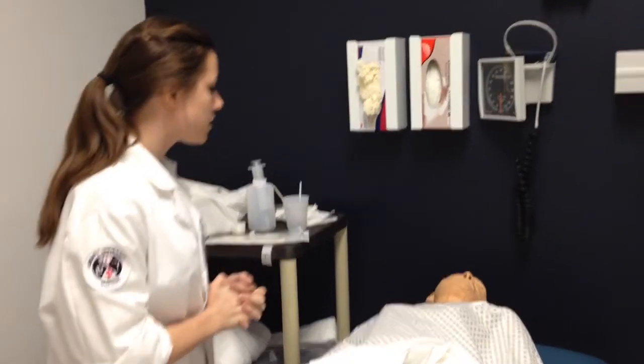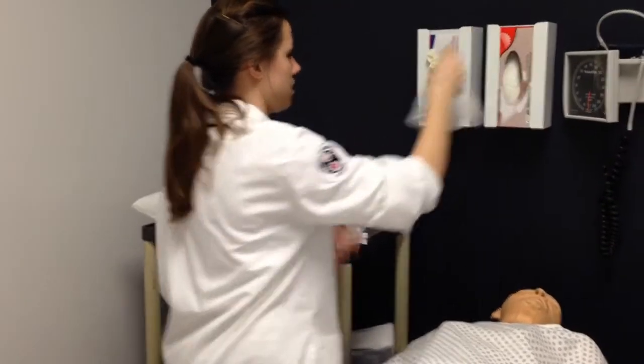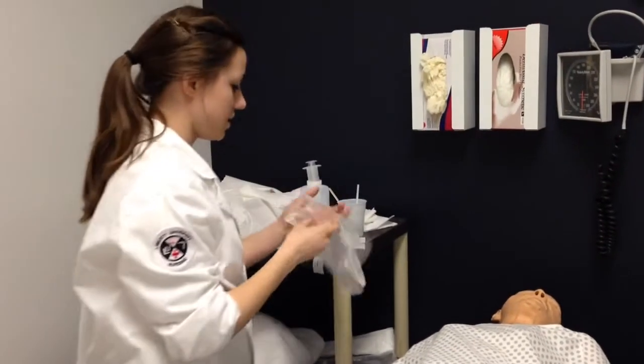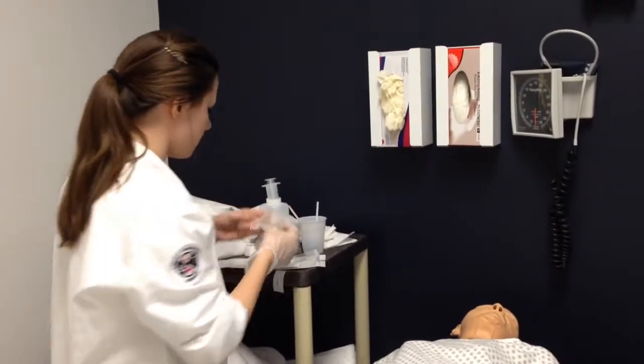So the first thing I'm going to be doing, it's a clean procedure, so I'm going to perform hand hygiene and put on a pair of clean gloves. And then from here, I'm going to have my assistant come and help raise you up in bed to a 90-degree angle.